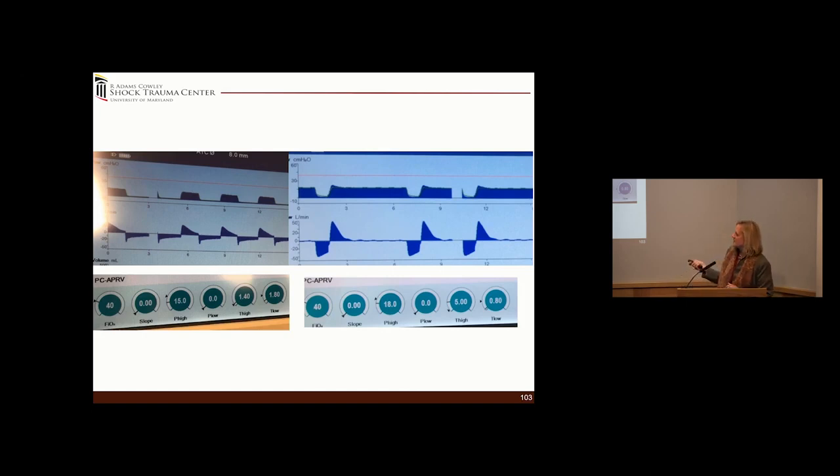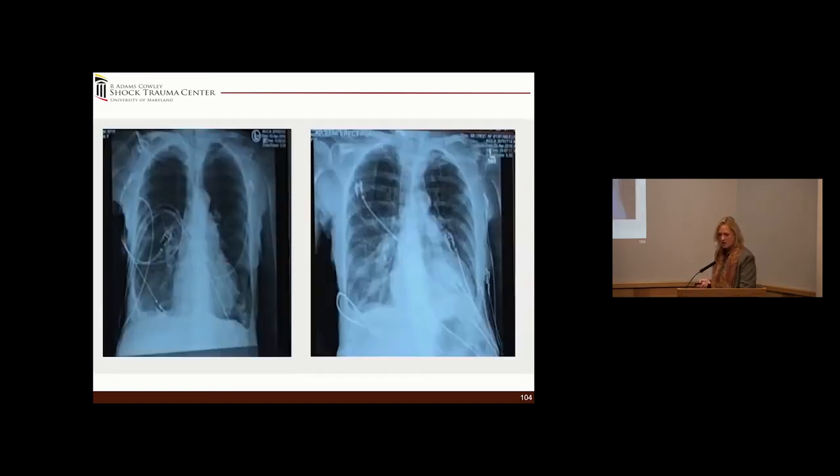Now what's interesting is almost 2 seconds. Do you see hardly any change here? I mean, it's still at 50%, so we can still go out even further. Can you believe that this is the same patient? Can an obstructive patient become restrictive? Yeah, you can lose lung volume, right? So this is the real COPD patient with those settings, and then when she received fluid, she had bibasilar collapse, so we needed to change the settings.